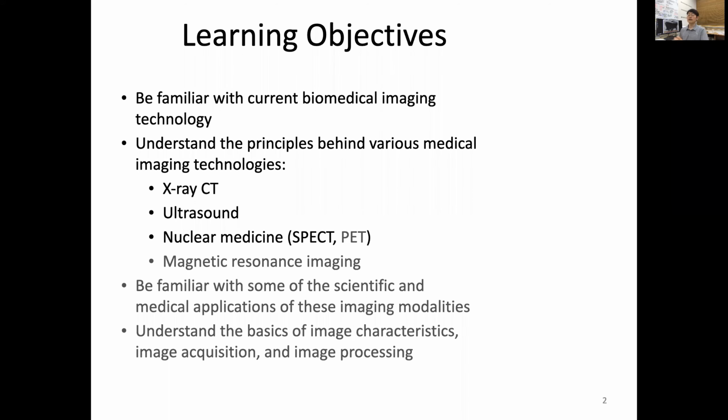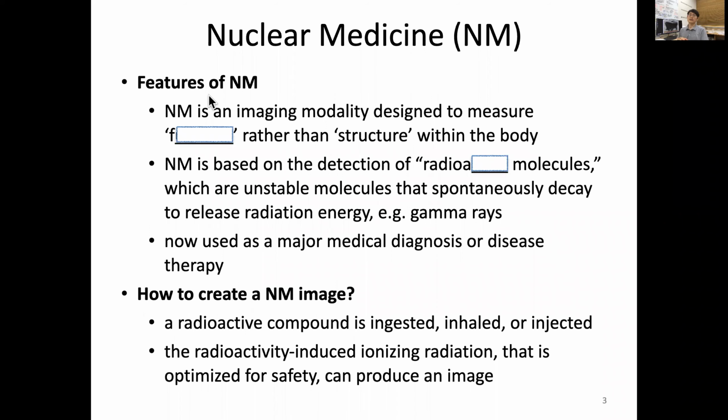Hi, now let's discuss nuclear medicine. So nuclear medicine is an imaging modality designed to measure function rather than structure within the body. So we are talking about function.